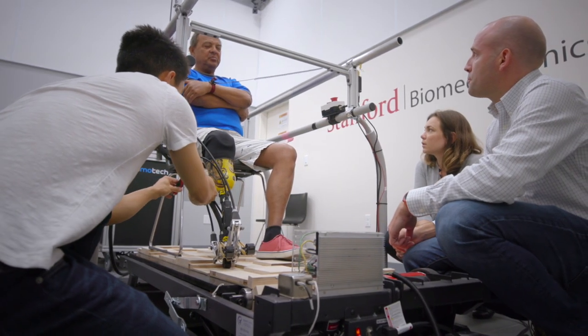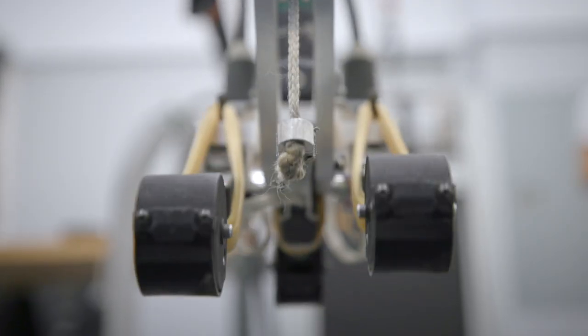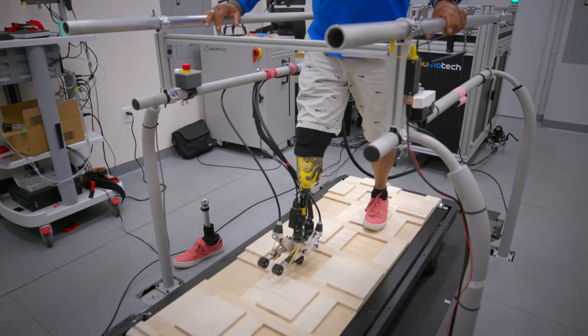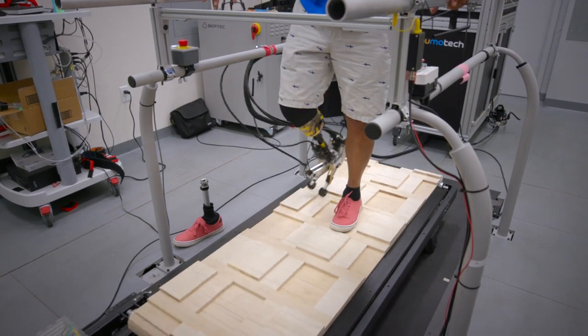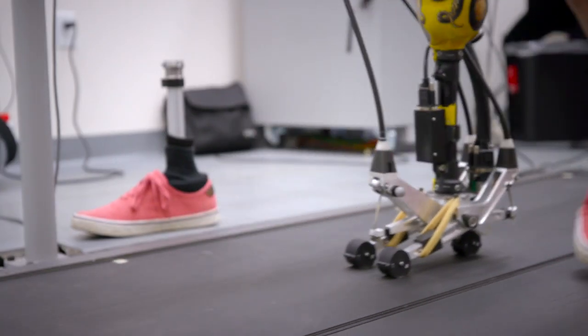On experiment day, a participant will come in. If it's their first time in the lab, we'll have a licensed prosthetist fit them to our device. After that, we will walk them through a series of conditions, so they'll just try to walk as normally as possible for about six minutes per condition, and while they're walking we'll be recording a variety of measures such as motion capture or energy expenditure.